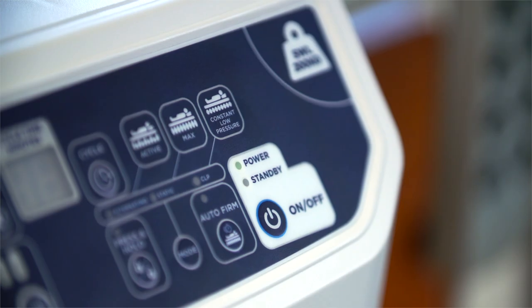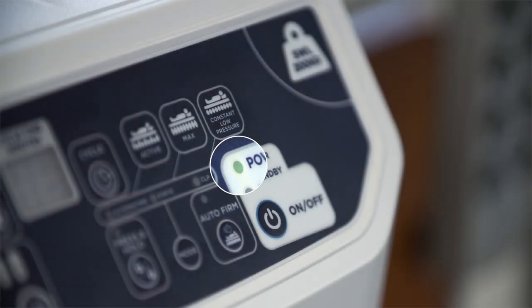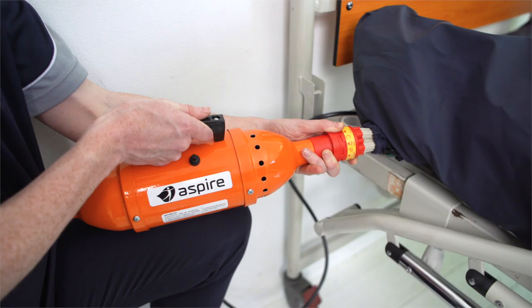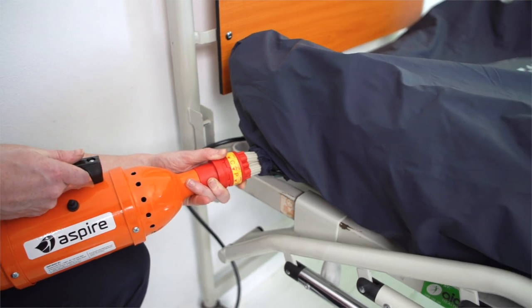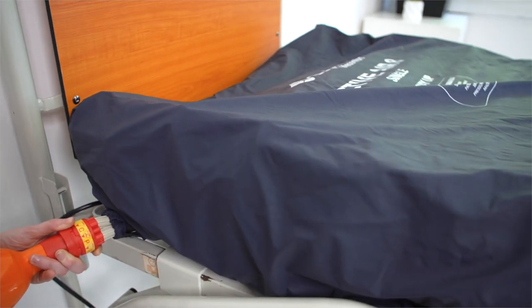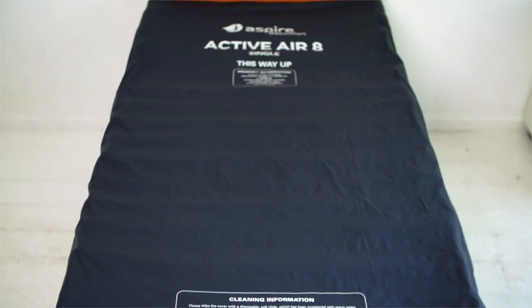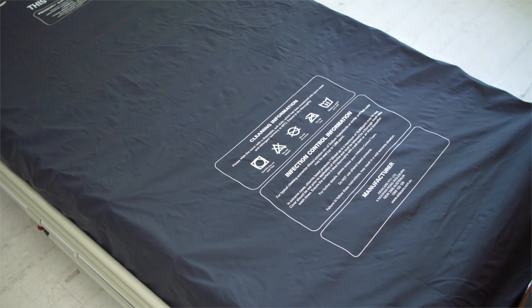Once plugged in and turned on, the power LED light will illuminate and inflation will begin. Inflation on most alternating air mattresses takes between 30 and 40 minutes. However, a rapid inflation turbo pump is available with the Active Air 8, allowing you to quickly inflate the mattress via the CPR valve, therefore minimizing wait time. When the mattress is fully inflated, you can then select the most appropriate settings, either automatically or manually.